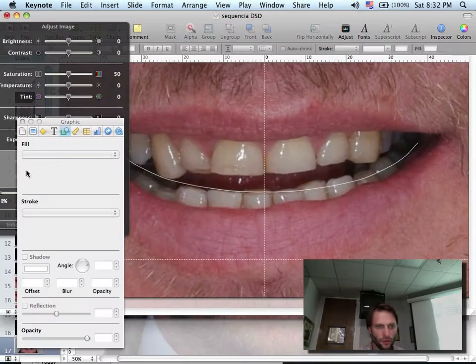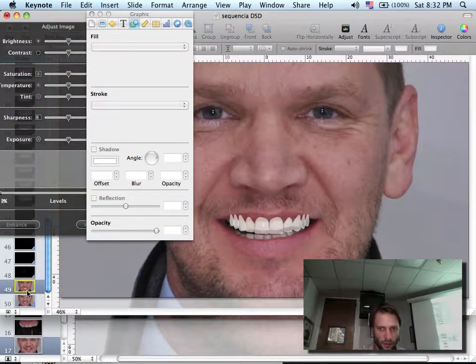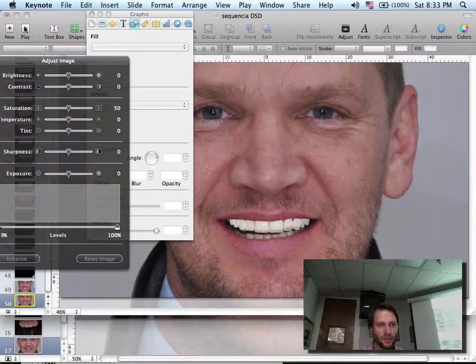The other thing you can do is to bring, like here you see I did all the 10, but instead of adding texture of teeth, I just added a white semi-transparent. And I think this is pretty much enough for the patient to understand what can be done. Okay? So he sees that it's fake, but he can see the improvements.